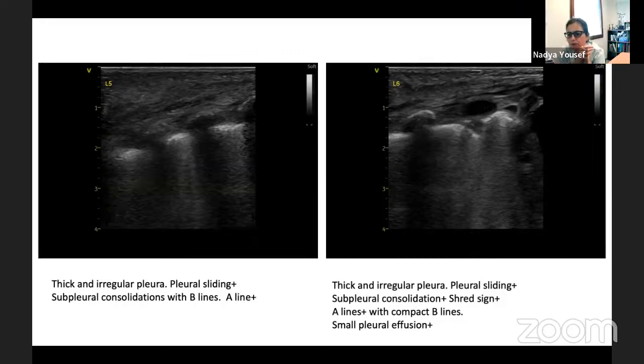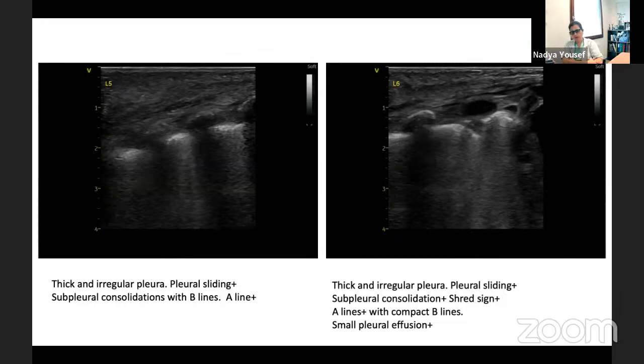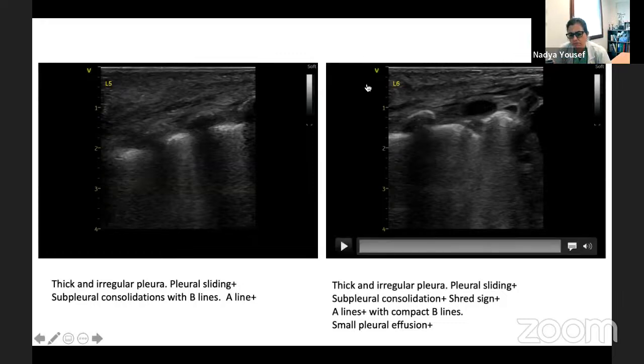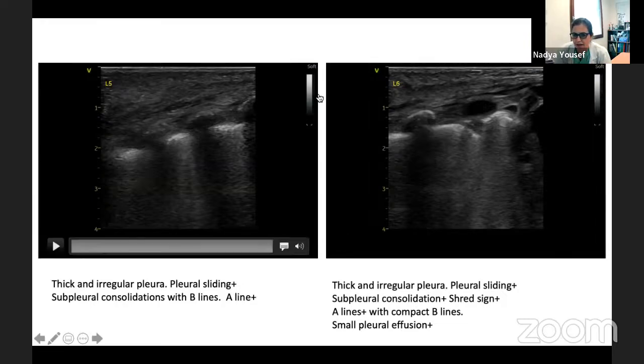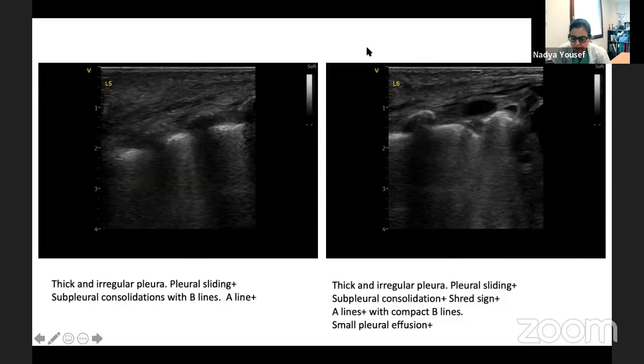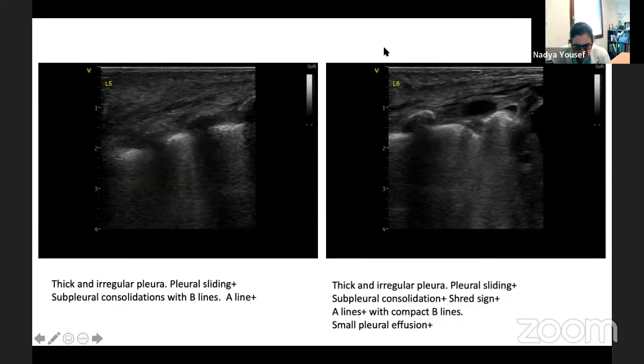But would you pick up a Noonan on that, or do you have to do some specific research? No, the geneticist feels that the Noonan will be covered with that. Okay, good. So, interesting case. I'll keep you posted. I think there's a diagnosis to be made on this, the mass on the right, whatever we're seeing on the right. But I think Doppler could be really interesting. Yeah, and next time I scan, I'll do the Dopplers. You have a couple more questions on this.